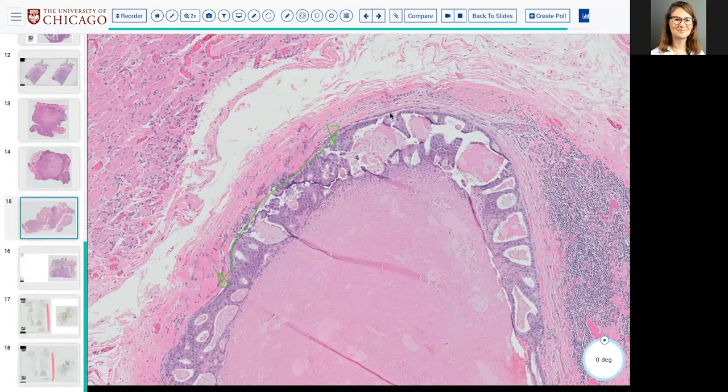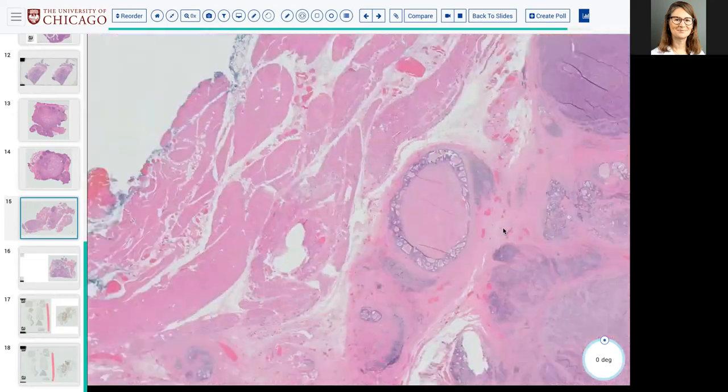In salivary duct carcinoma, which is what we're looking at, you can have areas that are truly intraductal, where you can highlight that outer layer, but that's usually a minor component of the tumor. Whether that be an in situ component or sort of pagetoid spread up the duct is debatable. But for the vast majority of cases, salivary duct carcinomas are infiltrative and high grade. And exactly, it looks like high-grade DCIS.